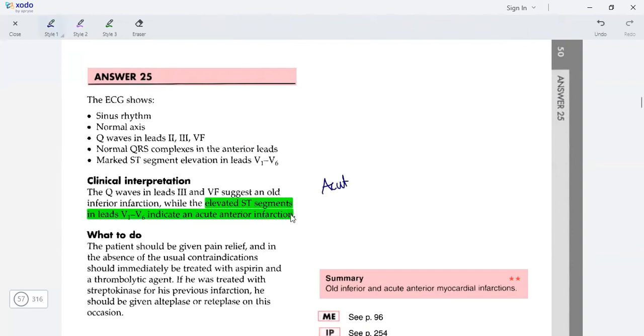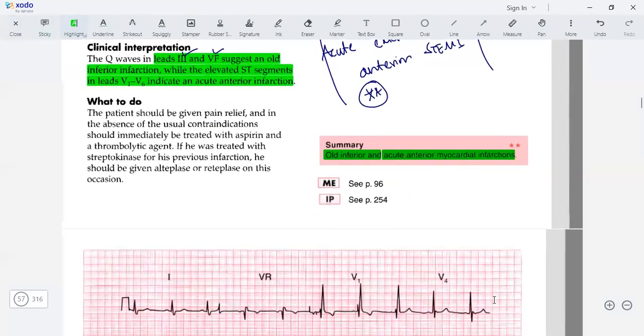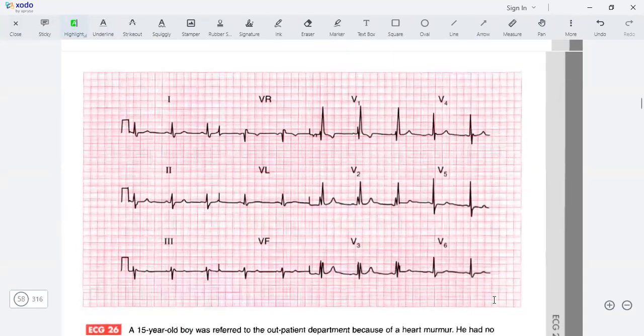This is acute extensive anterior STEMI. The Q in 3 and AVF suggests old MI inferior. Our diagnosis is correct: old inferior and acute anterior MI. We're doing well.